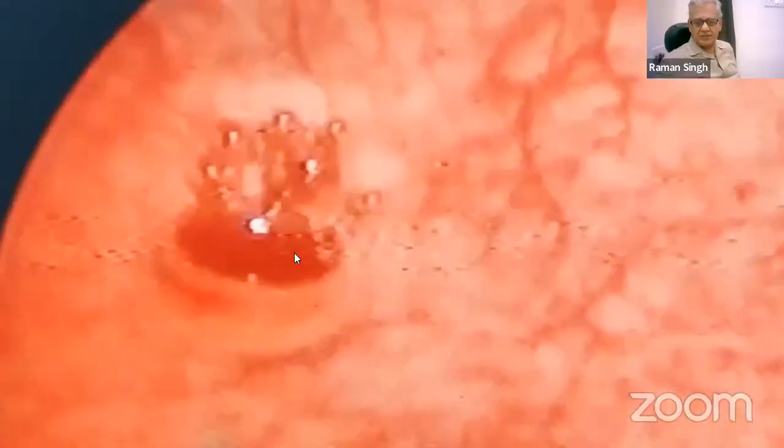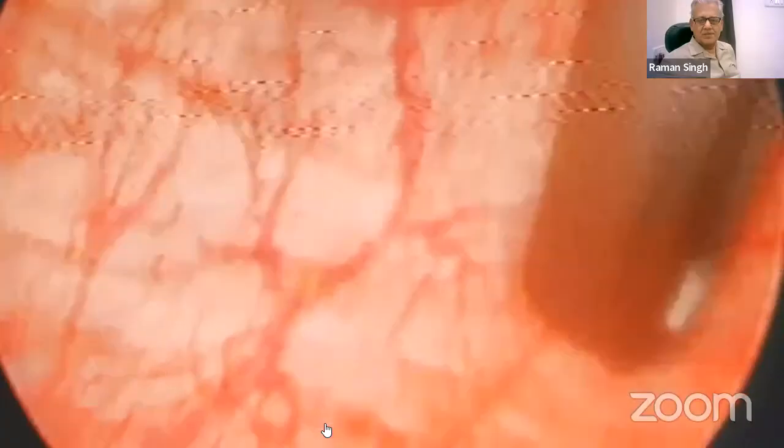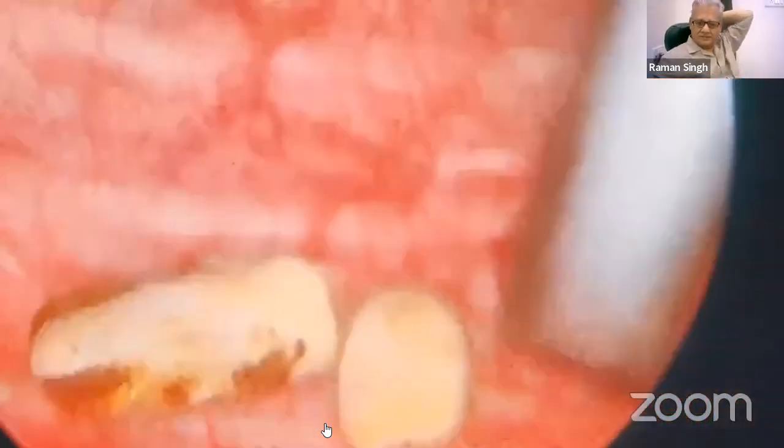So I had only laparoscopic instruments and did not have much urological instrumentation. There was no lithotripter. And the big stones, I thought how to remove them. And gradually one idea came to my mind, and in the suprapubic region I introduced a 10 mm trocar. After introducing the trocar, through that trocar I introduced the gallbladder extractor, and gradually I picked the stones one by one with the help of a grasper. And we also did this urological surgery.